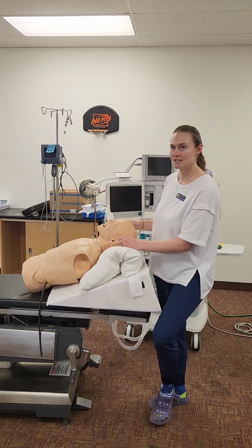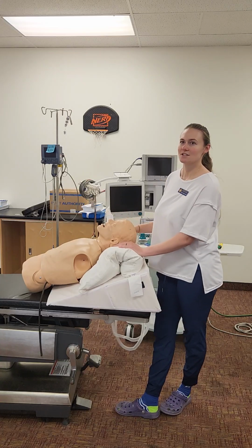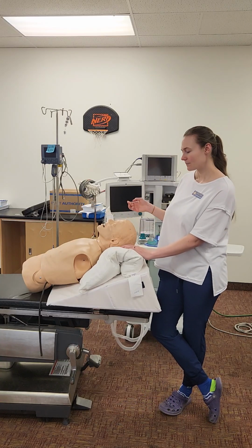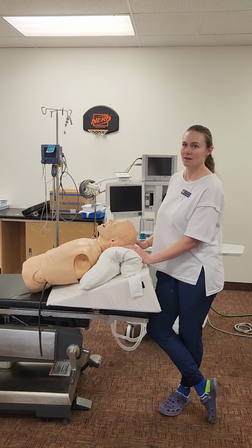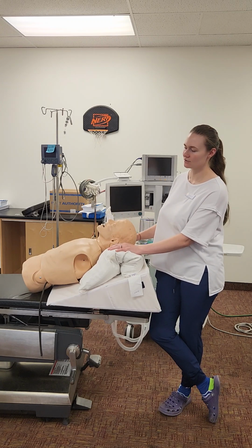Now I can tape his eyes, we can double check that everything went well and that he's ventilating still and everything worked, there's no issues. So now the procedure happens, and now the patient is ready to be positioned. So the circulator is going to come.